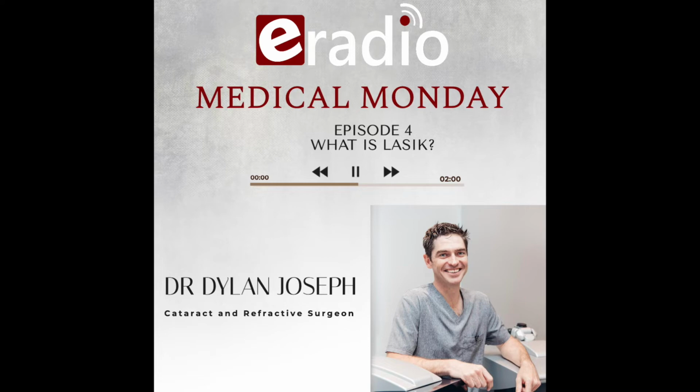So LASIK is where, as I've said earlier, we create a flap, we lift the flap, we laser, we put the flap back down. The beauty of LASIK is that it's a very quick visual recovery, so there's exceptionally minimal discomfort. Maybe the first 2 or 3 hours you can have a feeling of sand or grit in your eyes, and the visual recovery is exceptionally fast. A lot of my patients, in fact, that come down for LASIK, if they've driven a certain distance, the day after surgery, if they're seeing well enough, they drive themselves home.